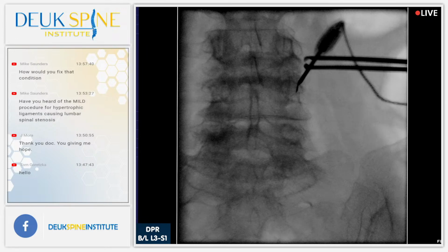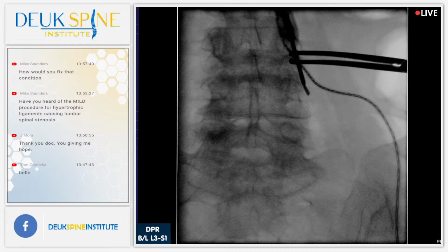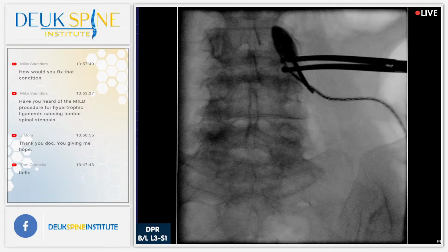All right, so you can see the transverse process. I want to be a little bit more lateral. Shot. Shot. See, that looks good to me. And we just got to go a little deeper. That's it right there. I feel the TP. Shot. That's pretty darn good.